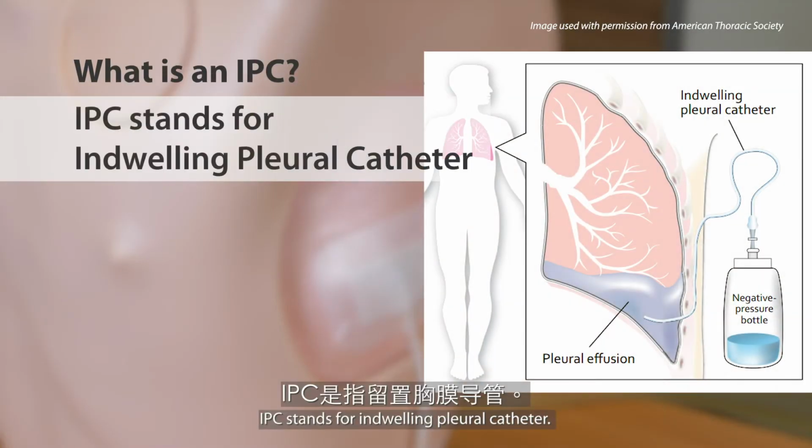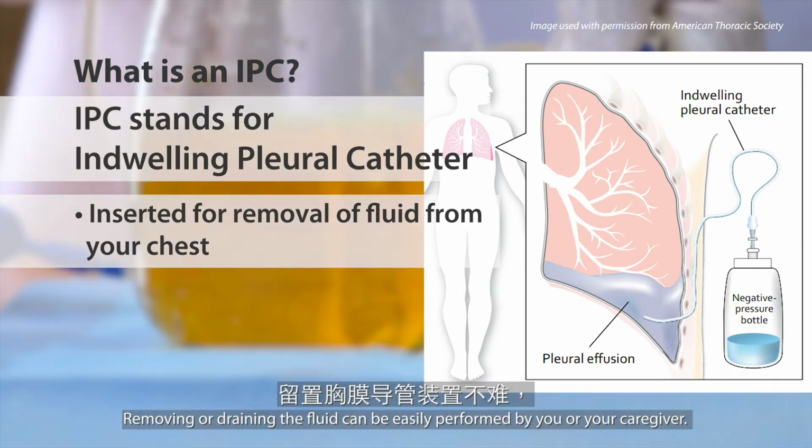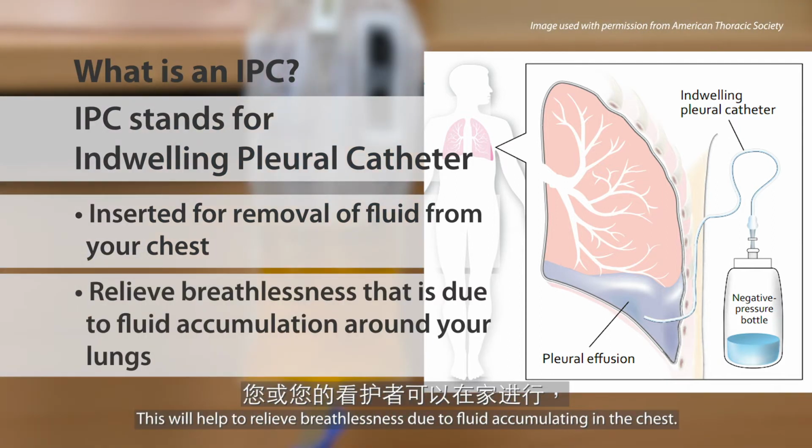IPC stands for Indwelling Pleural Catheter. It is a soft tube used to remove fluid from your chest without the need to come to the hospital. Removing or draining the fluid can be easily performed by you or your caregiver. This will help to relieve breathlessness due to fluid accumulating in the chest.